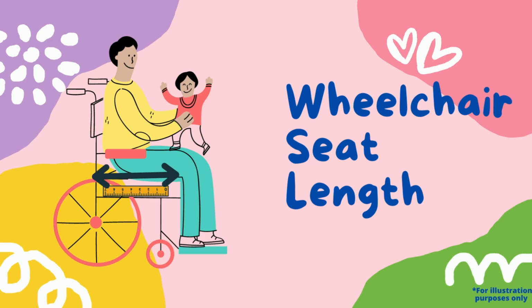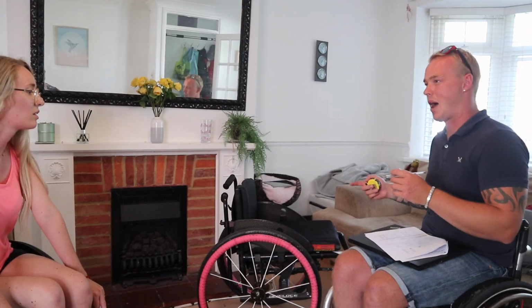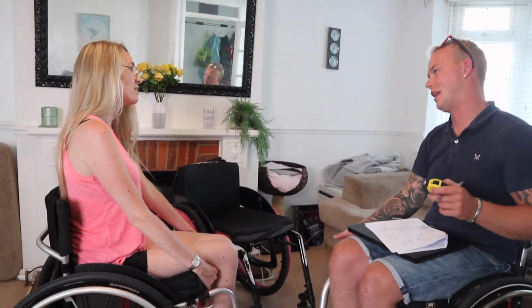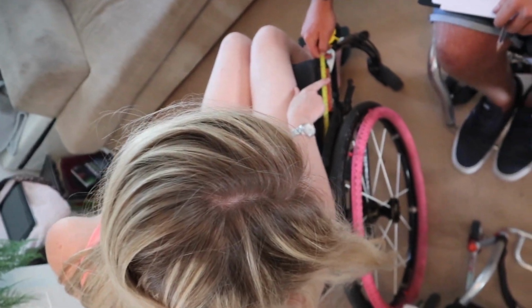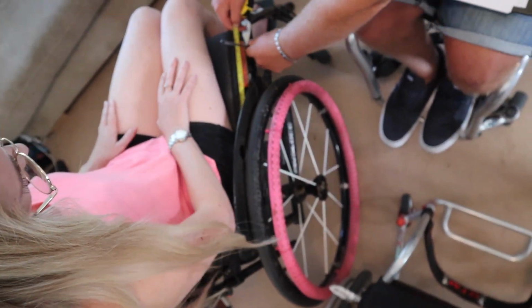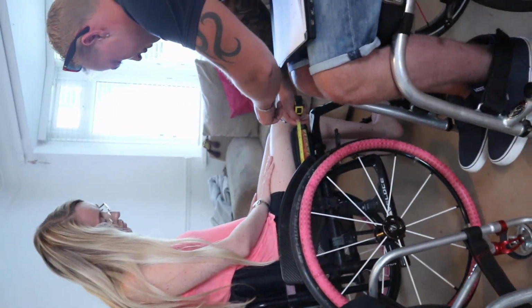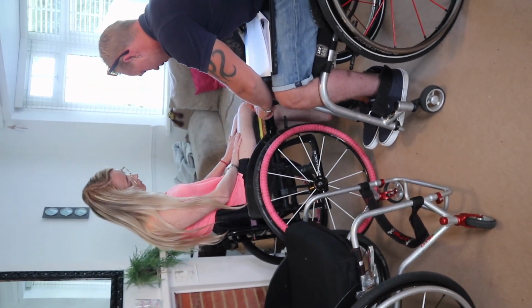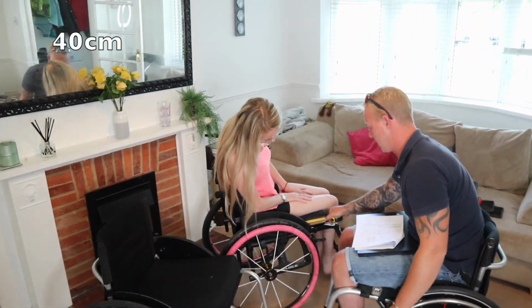Another question. So seat length. In terms of the length of your seat cushion, you're happy with? Okay. I do quite like these shorter ones. Yep. So you like a bit more gap underneath your leg? Yeah. You're in a 17-inch cushion at the minute. I don't want to go too much, because then you're going to have a lot of slack in between where your cushion sits and where your legs bend. But I'd happily allow a couple of centimetres behind, so I'd happily bring it to 40 comfortably. Okay.